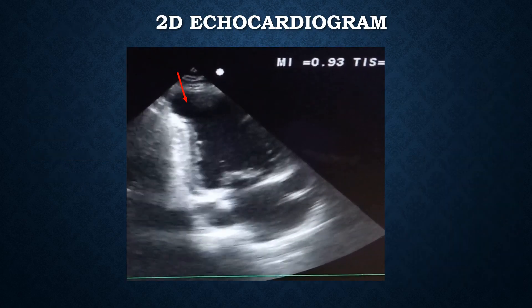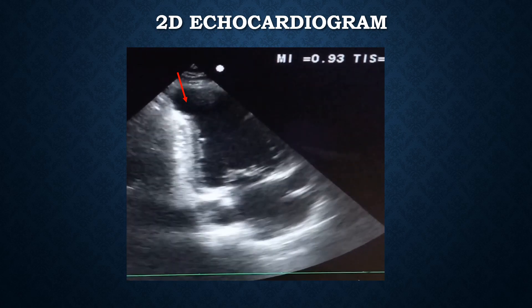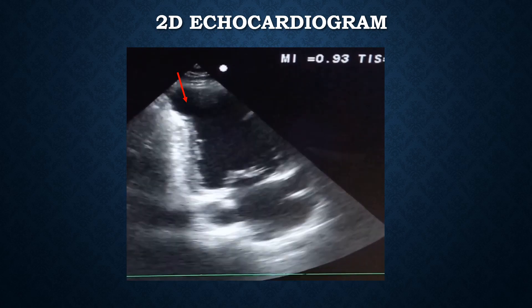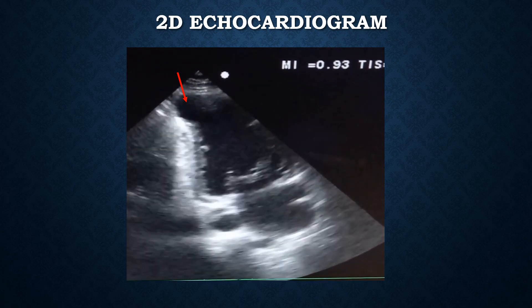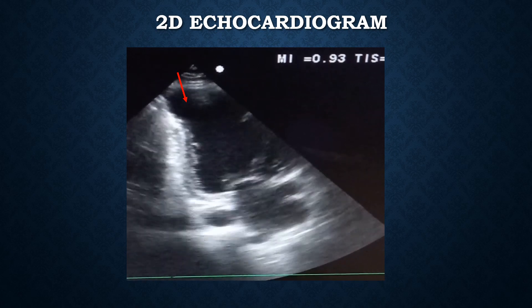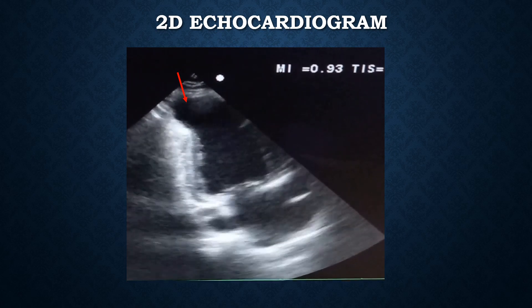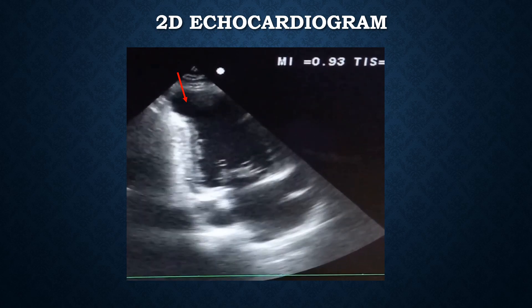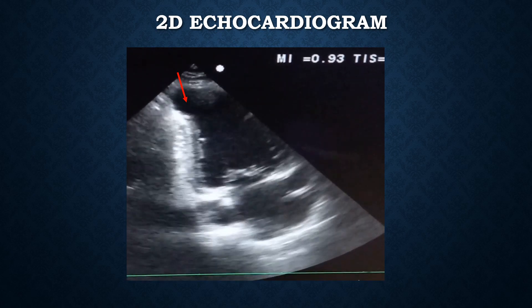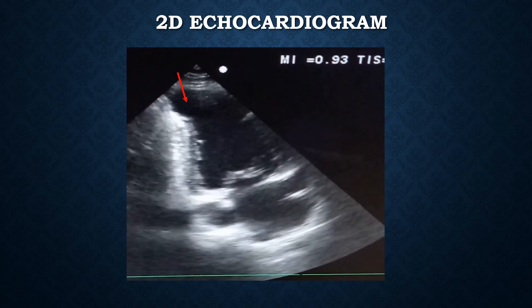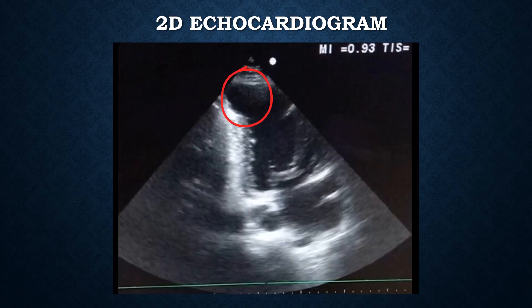Since the ECG and the applied rules were more supportive of LV aneurysm, we performed an echocardiogram on the patient. This echo clip shows the LV, with the arrow pointing to the portion that is not contracting well — it is bulging outward, favoring aneurysm formation. The area of the aneurysm is marked by a circle. The ECG findings and rules were confirmed: the echo was diagnostic of LV aneurysm in this patient.